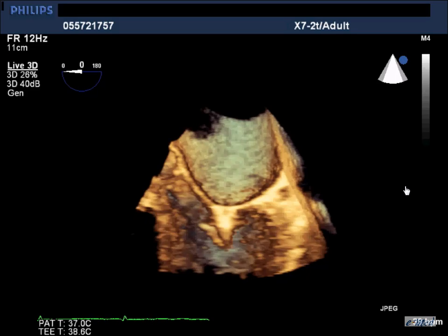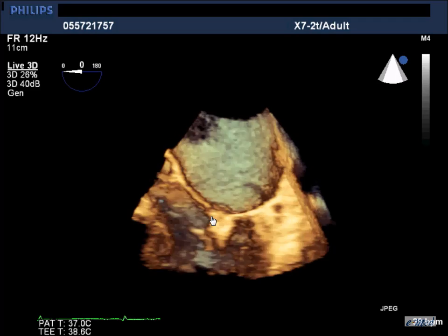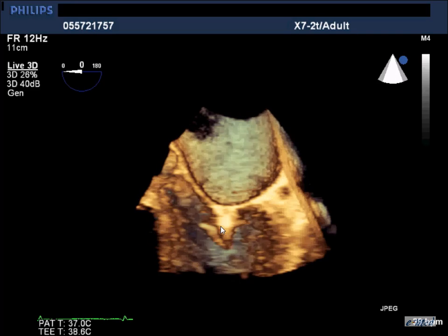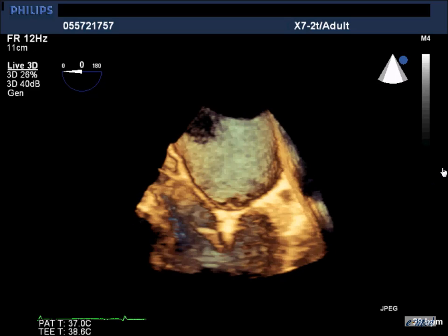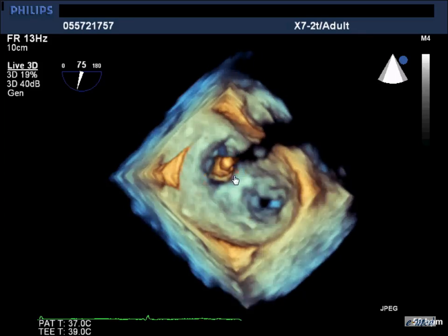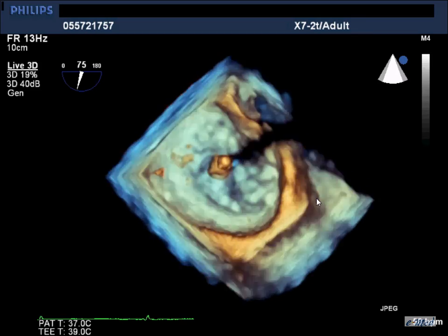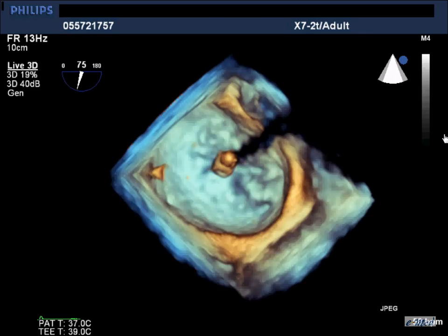Without going into full technique detail, you are supposed to grasp both leaflets. You can see in 3D that both leaflets are grasped with the clip, and you need to achieve a nice double orifice. You can see the double orifice with the mitral regurgitation before you release the clip.